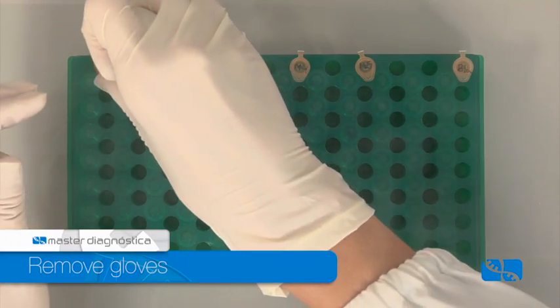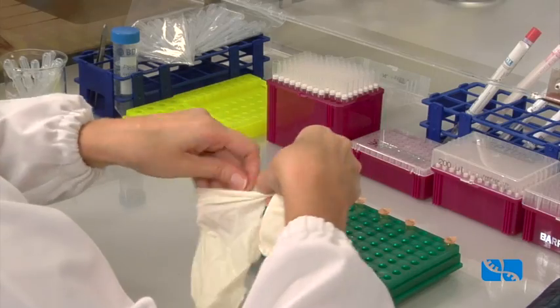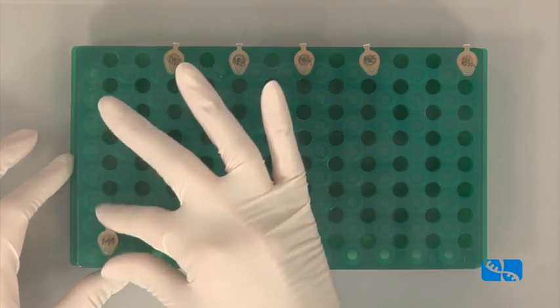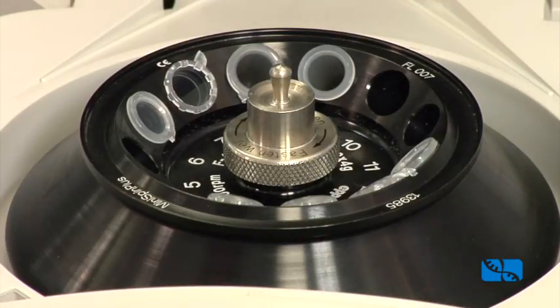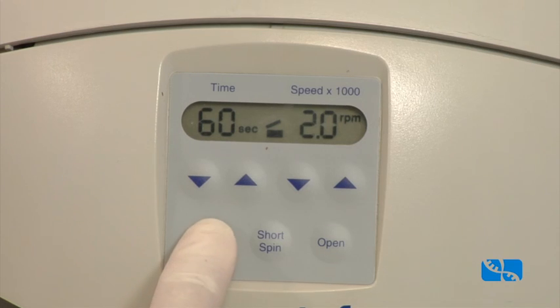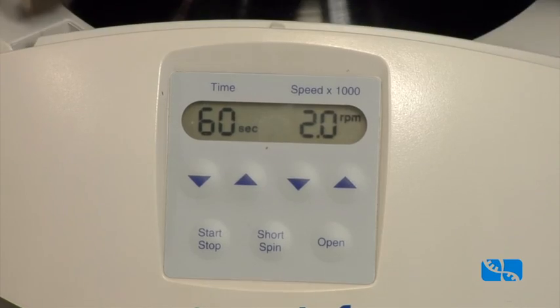Remove gloves and throw them away in order to avoid contamination between samples. Take the following sample and proceed in the same way as previously. Then, centrifuge the samples at 2000 RPM for 1 to 2 minutes. These cells would be ready to continue with the PCR step.